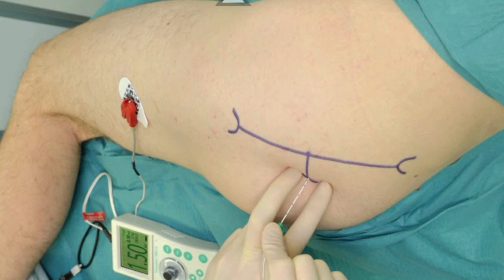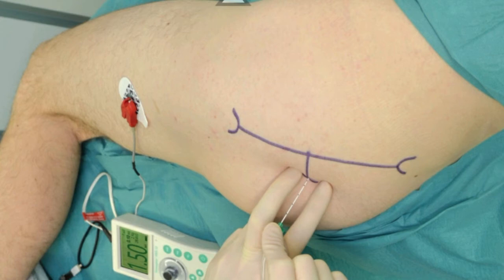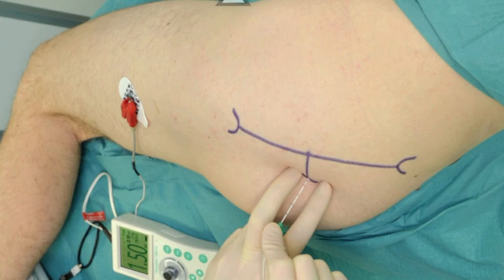The posterior approach to sciatic block has wide clinical applicability for surgery and pain management of the lower extremity. It is particularly well suited for surgery on the knee, calf, Achilles tendon, ankle, and foot.